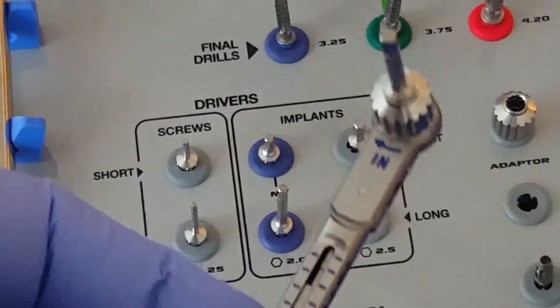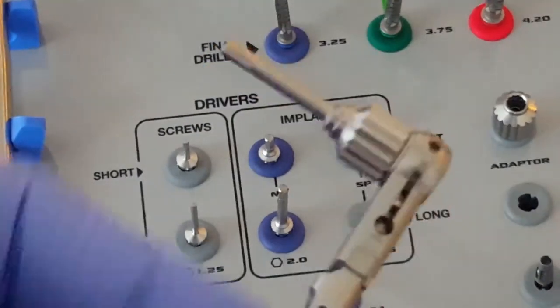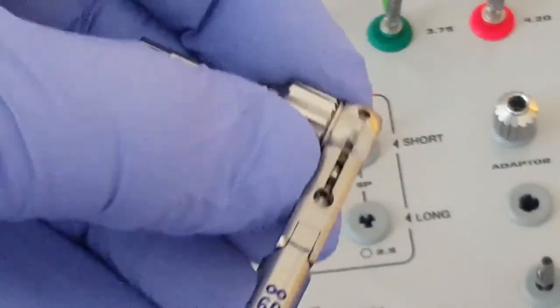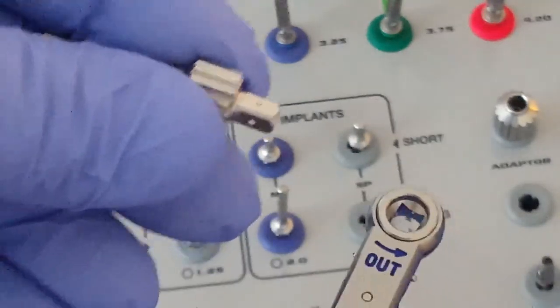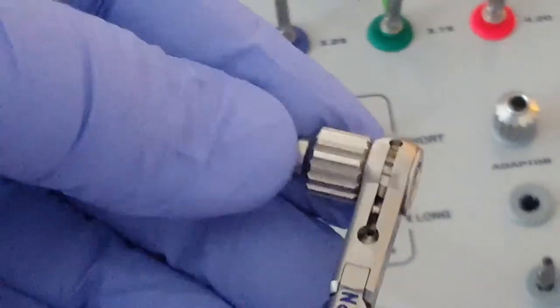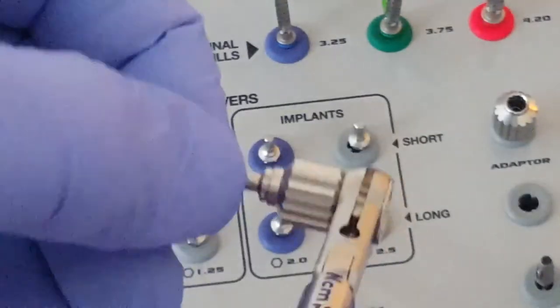If you want to reverse the implant, then simply remove the adapter with the implant insertion key. Go to the side that says out. Reinsert it, and it will now work in reverse.